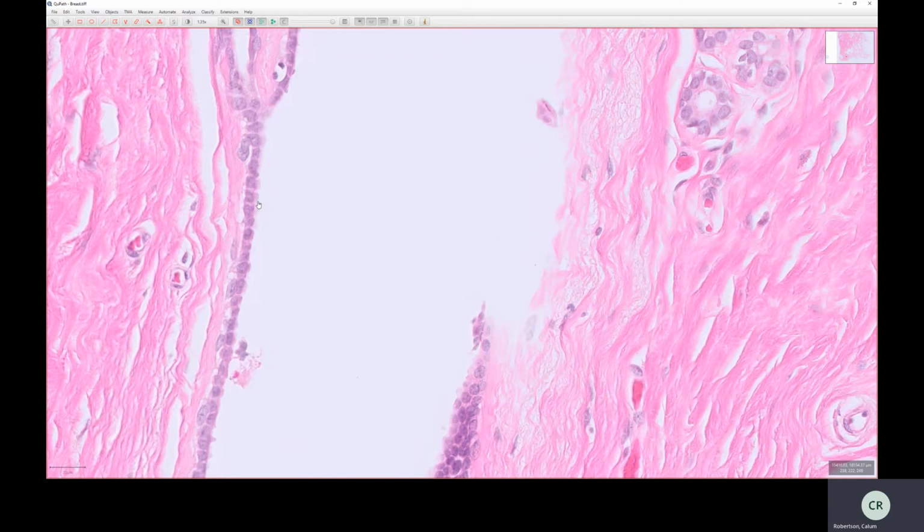Lots of apoptosis, which is just programmed cell death, which is happening, again, as a feature of the uncontrolled, unregulated replicating of cells. And if we see all of these things together as well as with the architectural features, we can put that together in a picture and come to the diagnosis of malignancy.